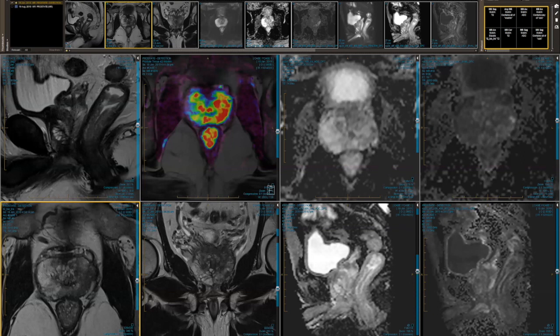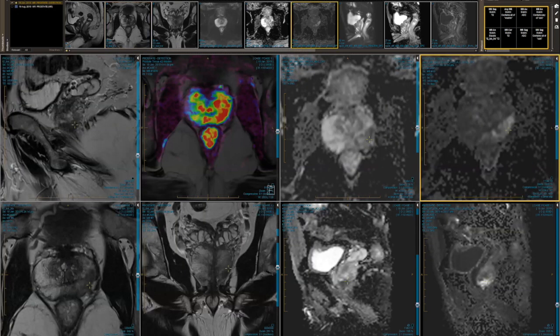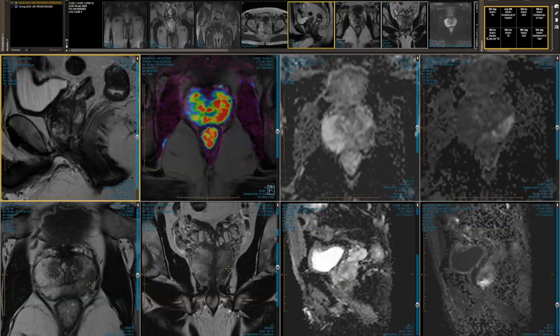And I think we shouldn't think that we need to work in isolation as radiologists, and we should make sure that we're part of a team. And I think certainly your data set, where you're getting feedback on your extracapsular extension, will make radiologists much better at predicting it. But we're never going to see small amounts of tumor that the pathologist can see.